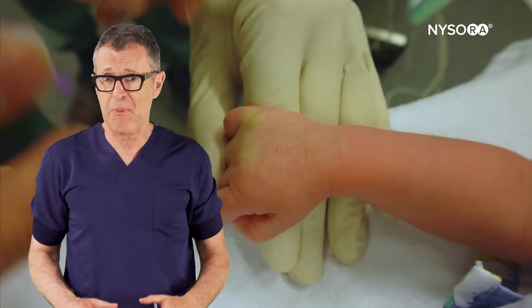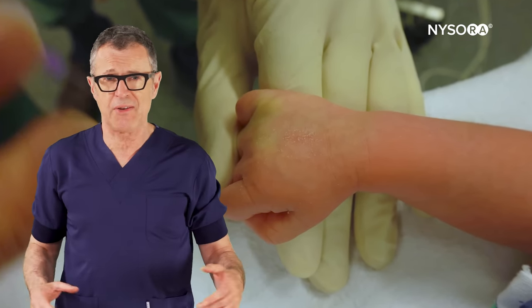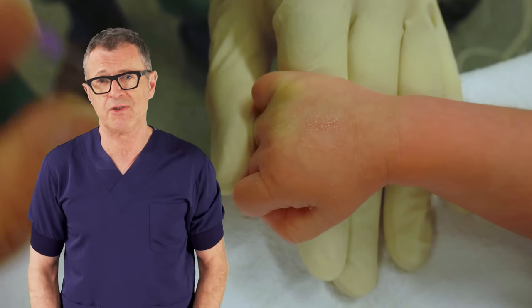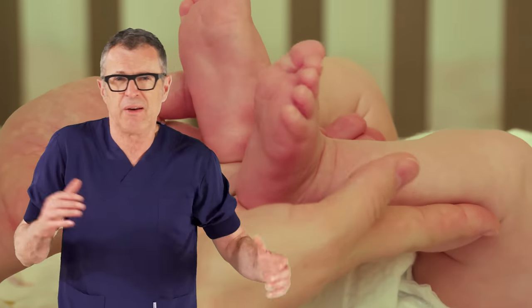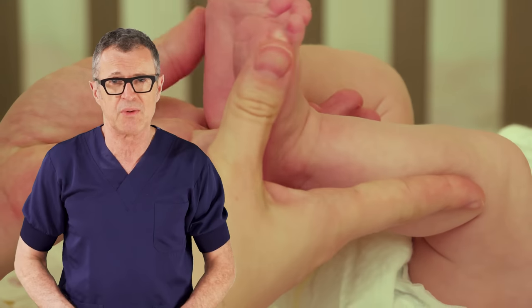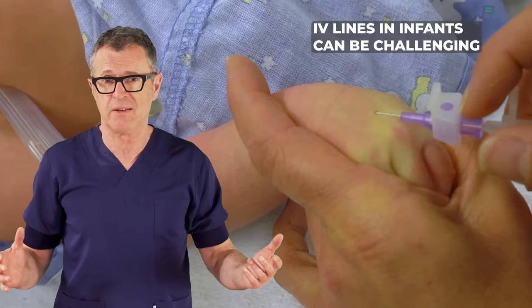I think we all agree that peripheral IV access can be really tough to secure in a baby. Inserting an IV catheter in a chubby, sick, or small baby can be particularly challenging. Infants are wiggly, their veins are very small, and they often have excess adipose tissue. All of these factors contribute to the difficulties of placing an IV line.